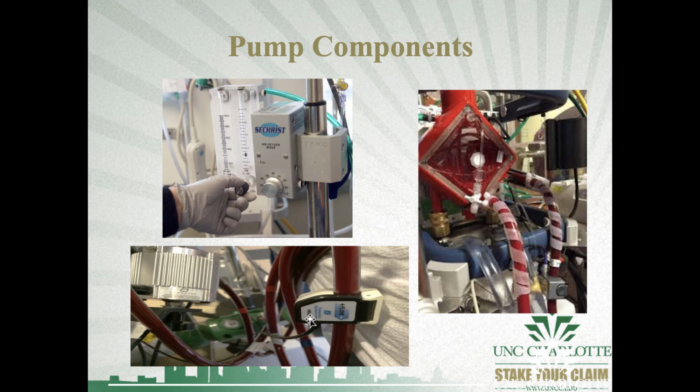Here you see sensors. So there are various sensors that sense flow, SvO2, and SaO2 levels on our circuitry and our blood. There are safety mechanisms built into certain machines. So for example, this CardioHelp has an air bubble sensor on our arterial limb. What that means is that if it senses an air bubble get into our arterial limb, which means that it goes back to our patient, which could be detrimental, it will shut down the pump and stop flow, and you'll subsequently clamp the circuit off and aspirate air out of here if you can. Worst case scenario, you change things out, which is not fun. But anyway, these provide safety mechanisms.